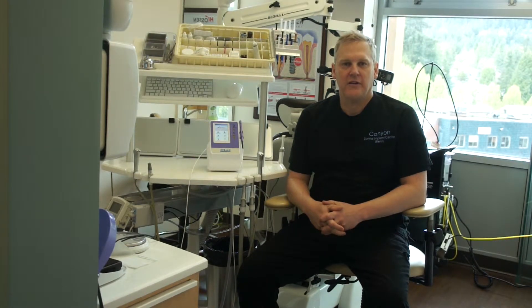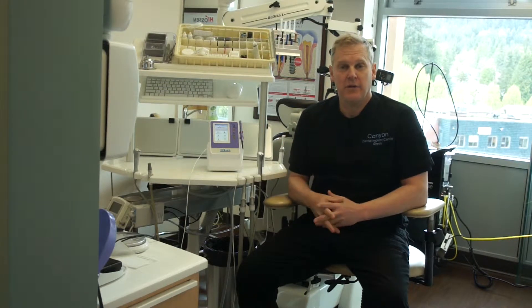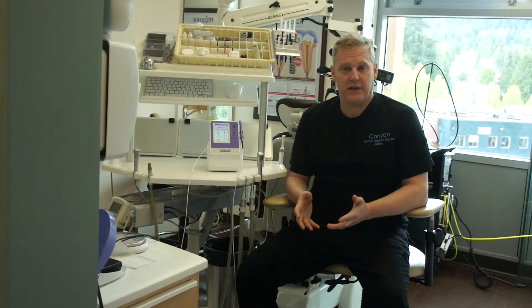Hi there, I'm Dr. Glenn Vanass. In today's version of diode laser training with the Zolar laser, we're going to be talking about the treatment of herpetic lesions.